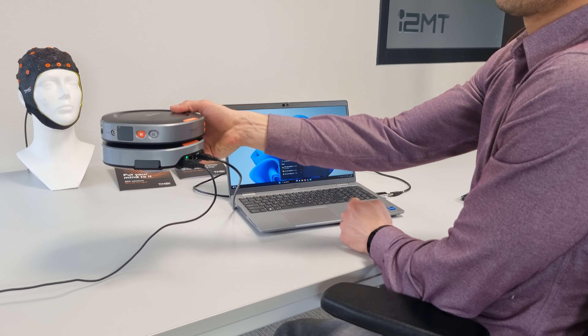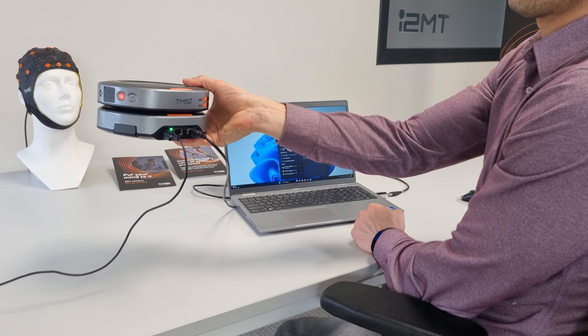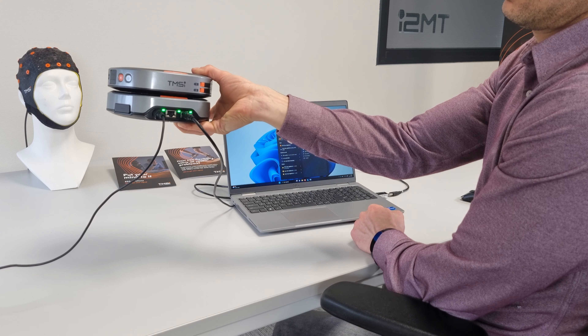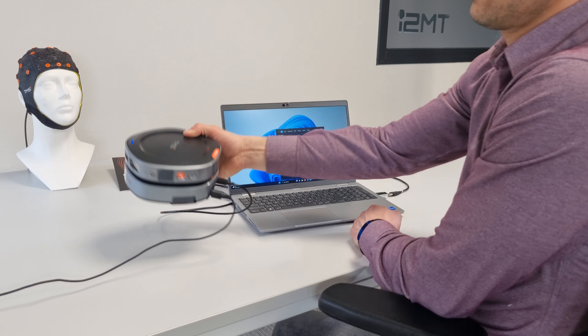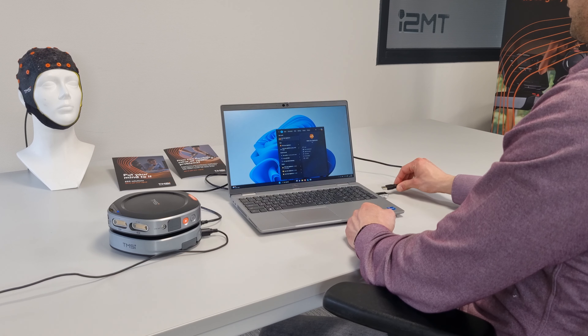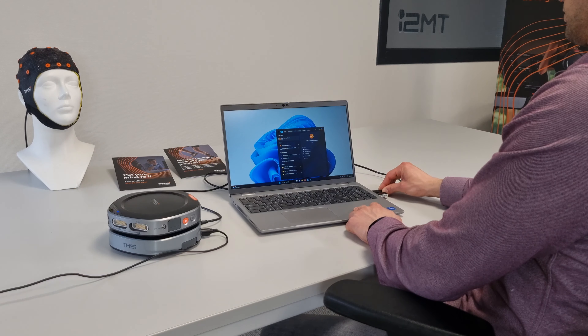Then connect the USB cable to the docking station. The LEDs on the back of the system will turn green. This will take around 30 seconds. Then connect the USB to your PC.